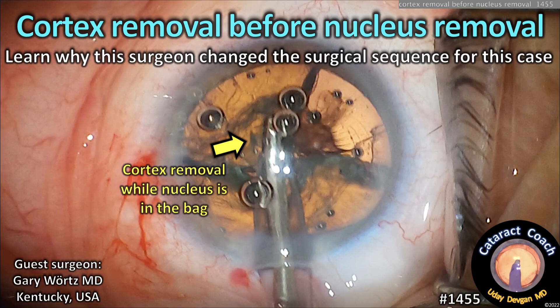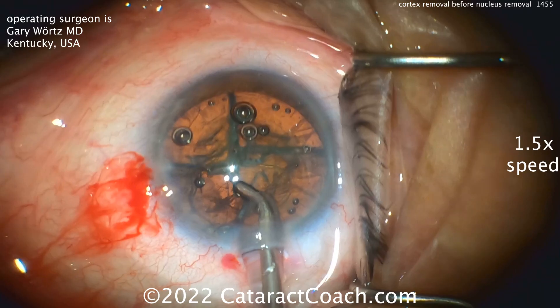Catered at Coach.com. Cortex removal before nucleus removal. Learn why this surgeon changed the surgical sequence for this case.